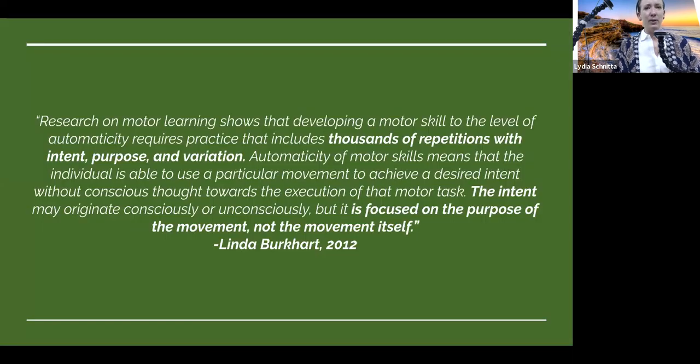So this is a slide where I remind you that you can't do this only on the iPad. Learning to use switches and learning to use them autonomously so that you can communicate takes thousands of repetitions.